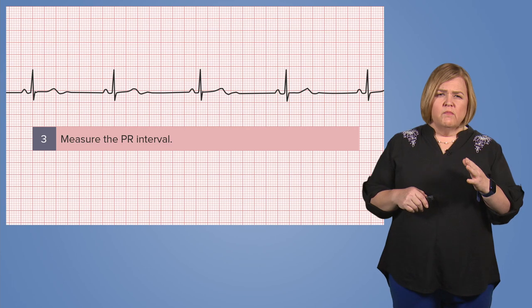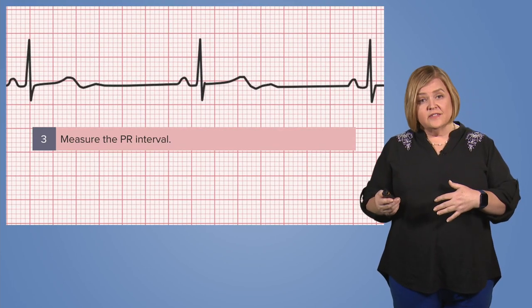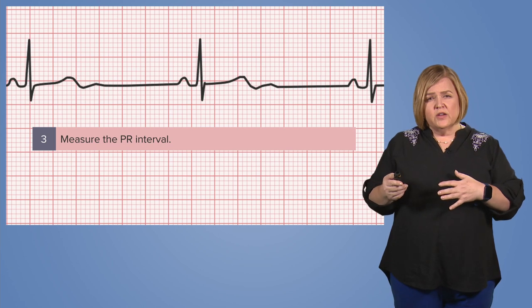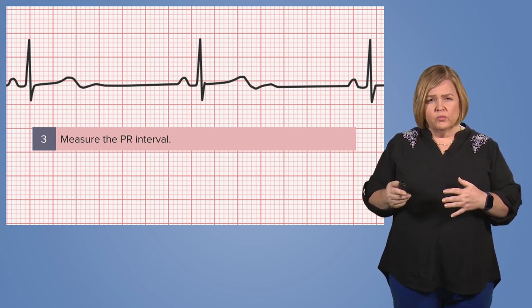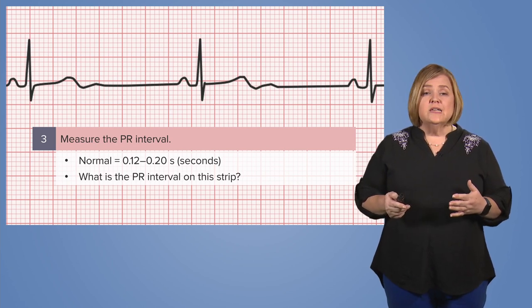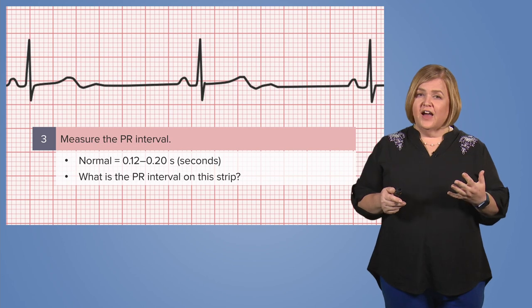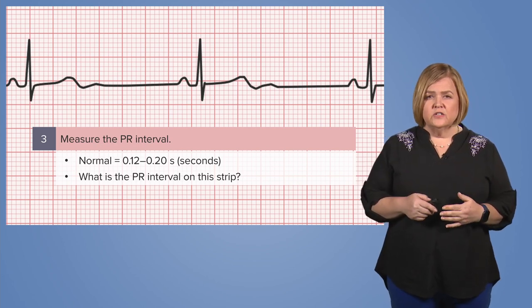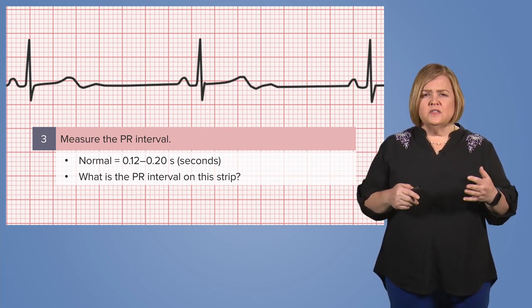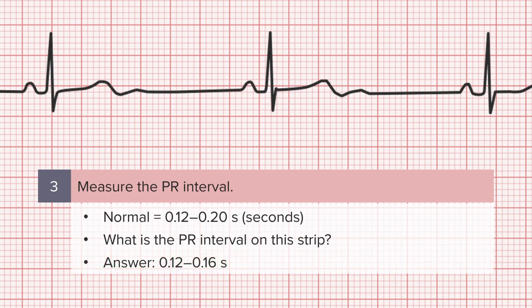Next, measure the PR interval. We have a P wave for every QRS, so you want to measure that PR interval to make sure it's within the normal range. A normal range for PR is 0.12 to 0.20 seconds, or 3 to 5 small squares on ECG paper. Take the time to measure it using the small boxes and compare your answer with what you see on the screen.